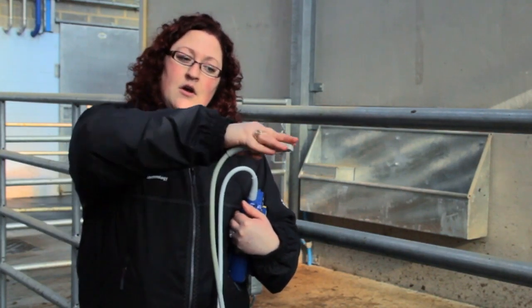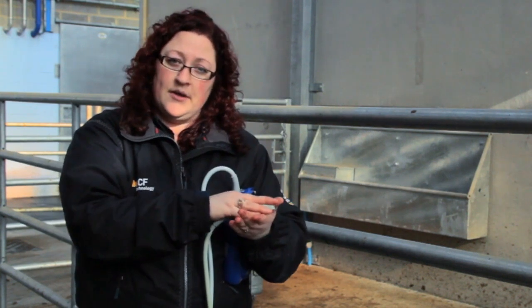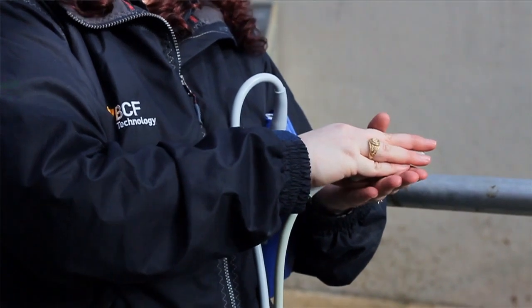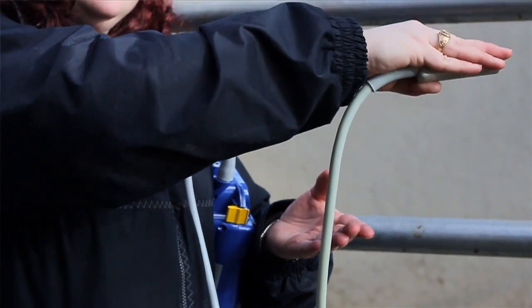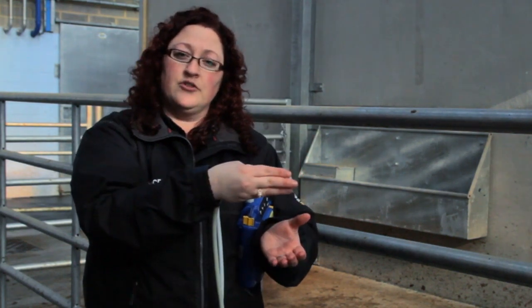The final movement that we can make is rocking or tilting the probe. This again will help us to get an improved level of contact with the rectal floor to improve the quality of our image, and it will also enable us to get a different view of structures within the cow. So for example, on the ovary, what we may be able to do is tilt or rock side to side so that we can look at all of the structures within the ovary, including the corpus luteum, follicles if they're present, and any potential pathology.